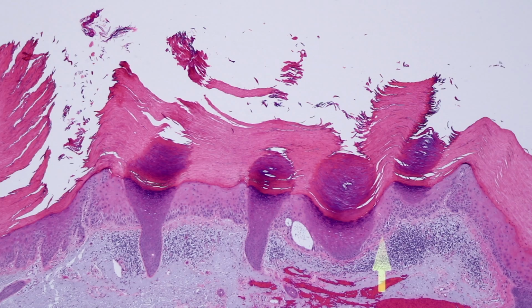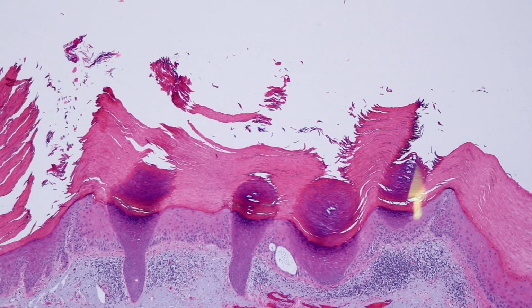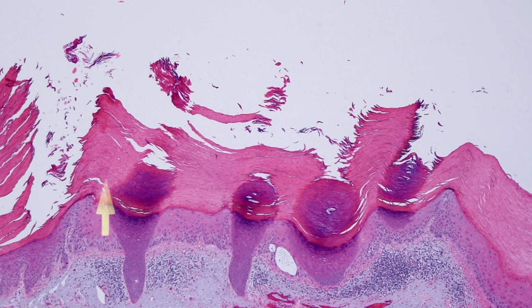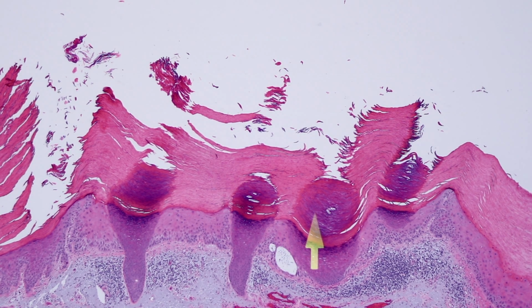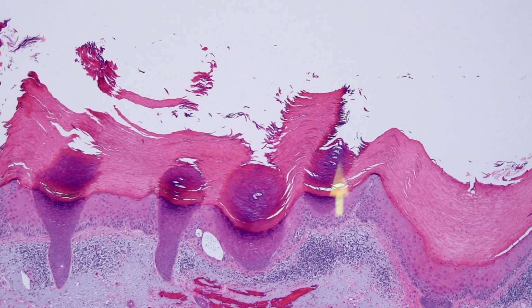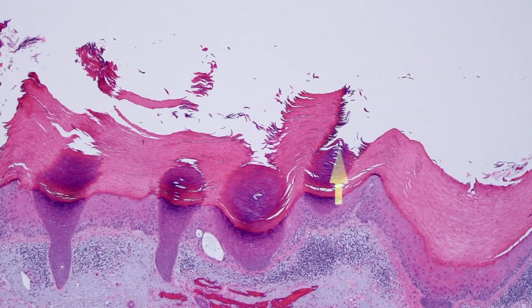So anyway, what we call this is the flag sign, and it depends on what kind of flag. I'm an American, so I think of an American flag, that it's kind of the red, white, and blue, that these are the red and white stripes, and then here's the blue field with the stars. You know, again, in dermpath, you have to have a really good imagination about things, and pretend that you see stuff sometimes. I've also seen people say, well, some of the countries have 3 vertical bars as their flag, and so it could be representative of a flag like that.